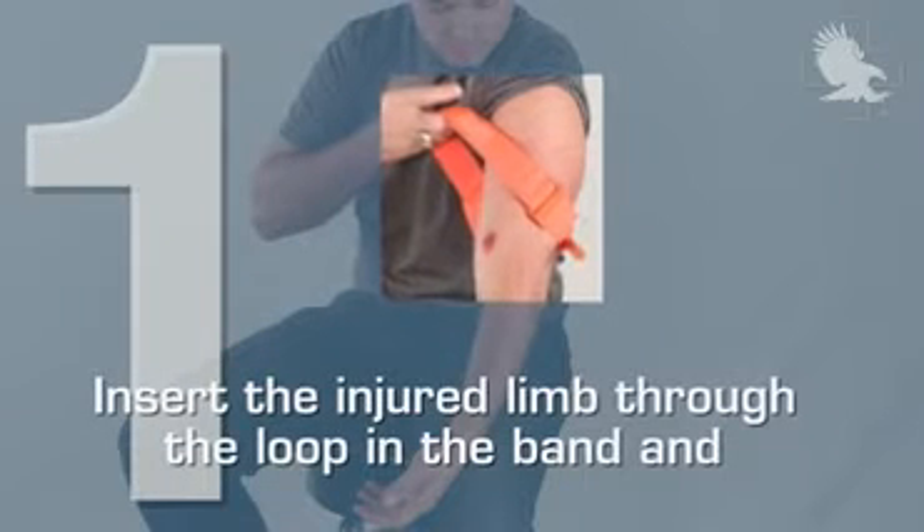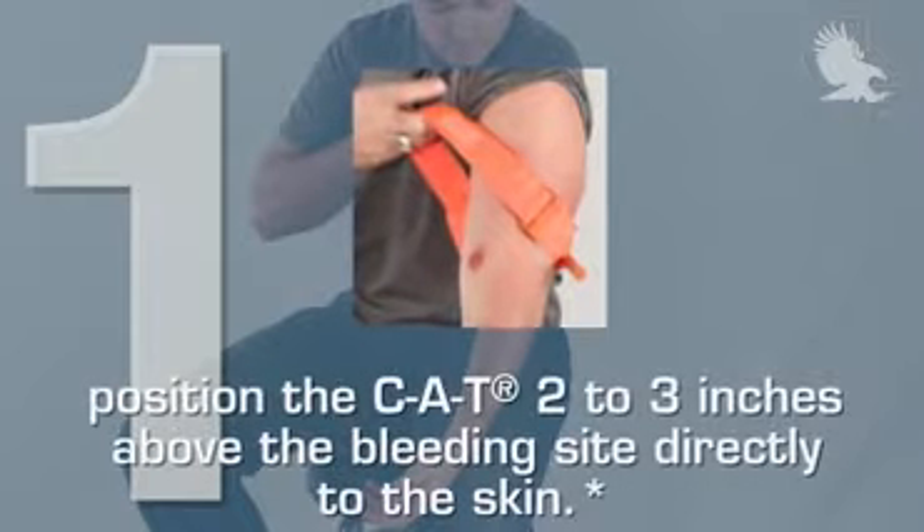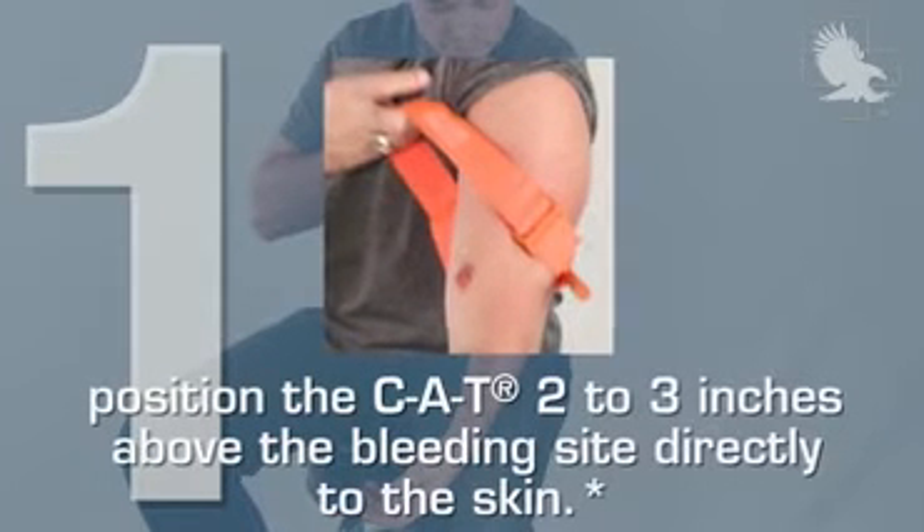Step 1. Insert the injured limb through the loop in the band and position the CAT 2-3 inches above the bleeding site, directly to the skin.